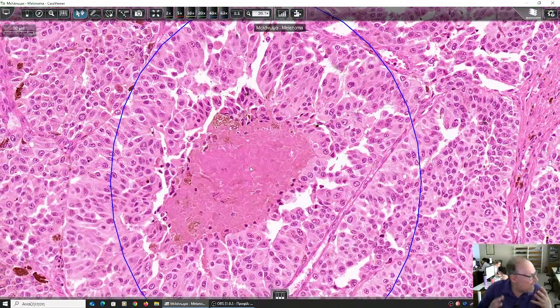So what is this area that we find within the neoplastic population that is compatible with its malignancy? Yes, please, tell me. It's necrosis. Yes, this is necrotic activity. And as we said in the general principles of neoplasia, if we have necrotic activity within a neoplasm, this is a sign favoring malignancy. So this is a necrotic area. Small one, but it's necrotic.